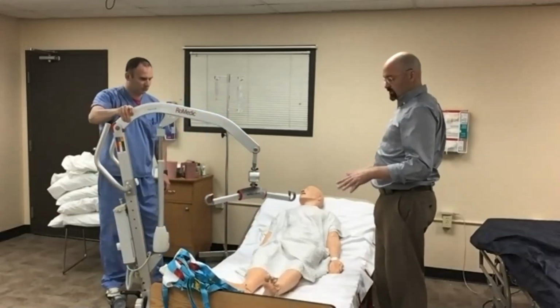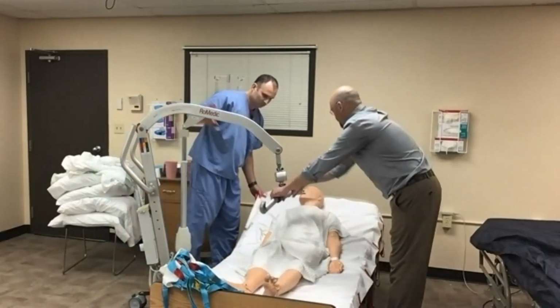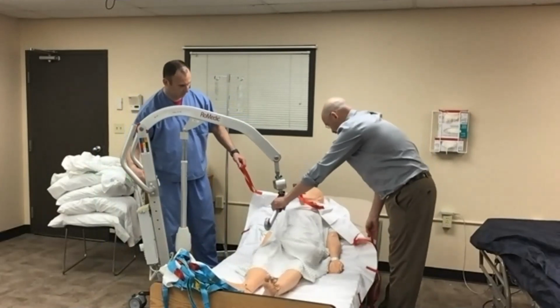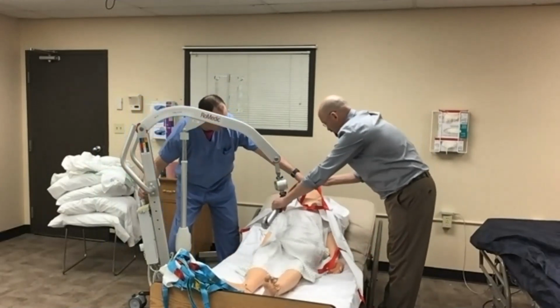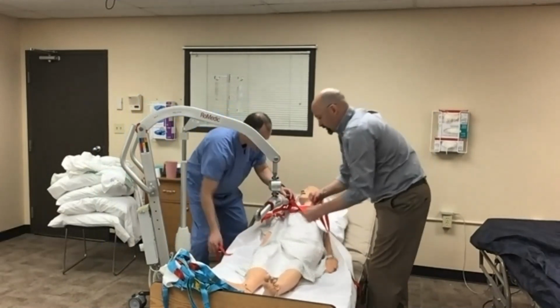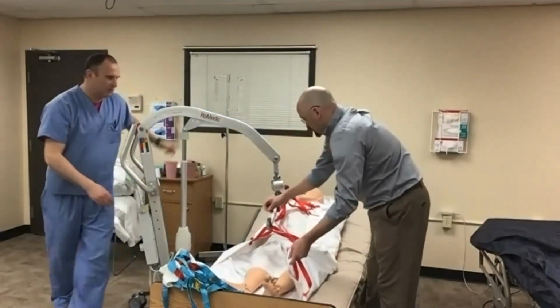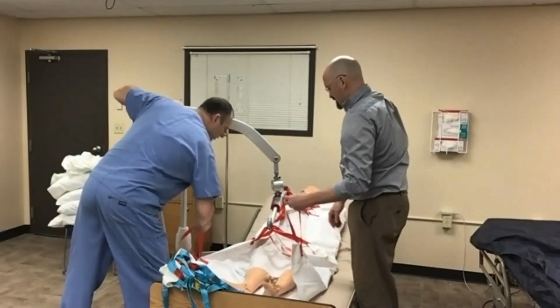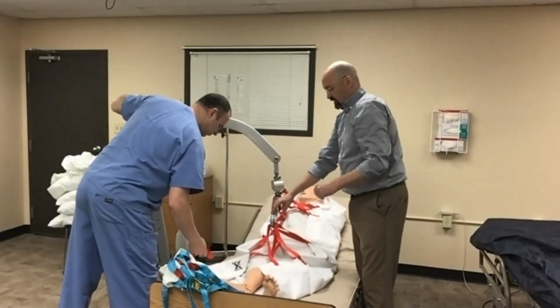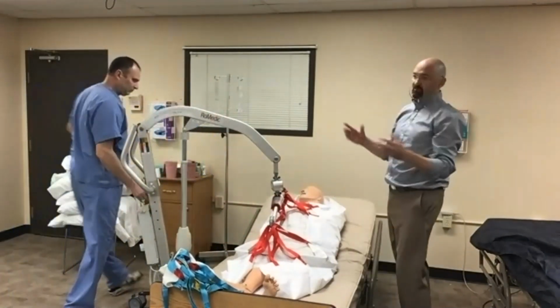So first thing we're going to do is we've got our patient who's on a repositioning sheet. We're going to bring the system in. We're going to apply our repositioning sheet. We're going to leave the head on for this. Make sure that you're on the same point of attachment for each strap. Now this is an older repositioning sheet. So what you're going to see is it only has one set. Most everybody else has two.